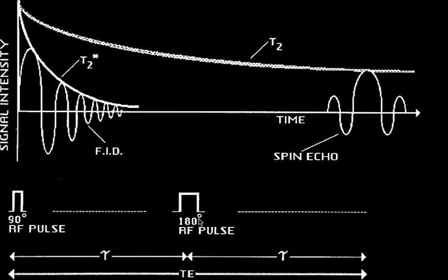So when you put in a 180-degree pulse, all you're doing is flipping the nuclei 180 degrees, and you're not forcing anything into the XY plane, so you don't get any more T2 star signal. If it's not 180 degrees or 180 degrees plus n times 360 degrees, anything else is going to force some bulk magnetization vector into the XY plane, and then we would get a signal. We'll see that we do this a lot in steady state free precession type imaging. But we're not there yet.